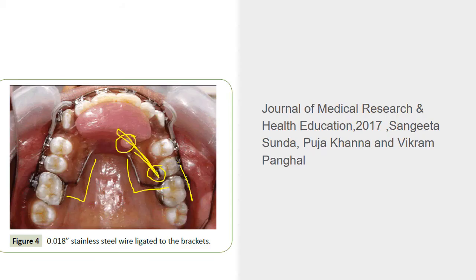Now let's discuss modifications. One modification shown here is a post-treatment appliance. During alignment and leveling, the authors bonded a begg bracket on the palatal surface of the premolar, and an acrylic nodule was added to the Nance palatal button. This is not a regular Nance palatal button — there is a bend placed within the palatal wire, the palatal button is larger, extending all the way to the palatal surface of the maxillary incisors — essentially modified into an anterior bite plate.